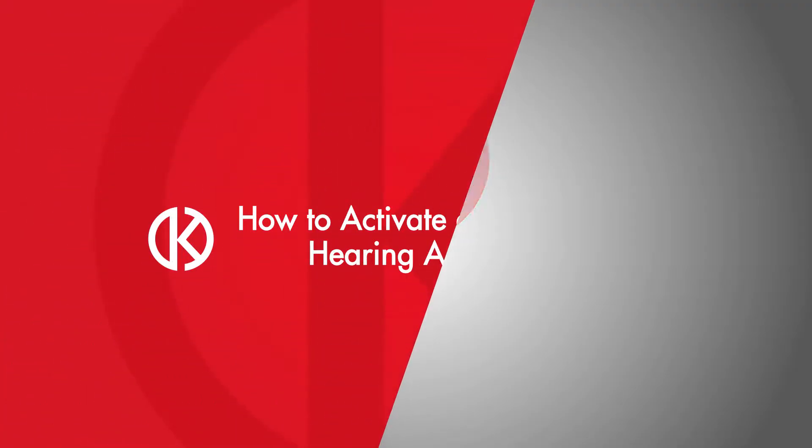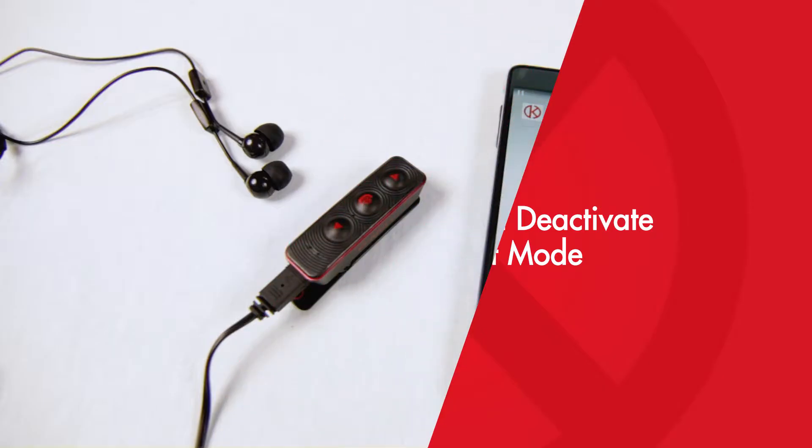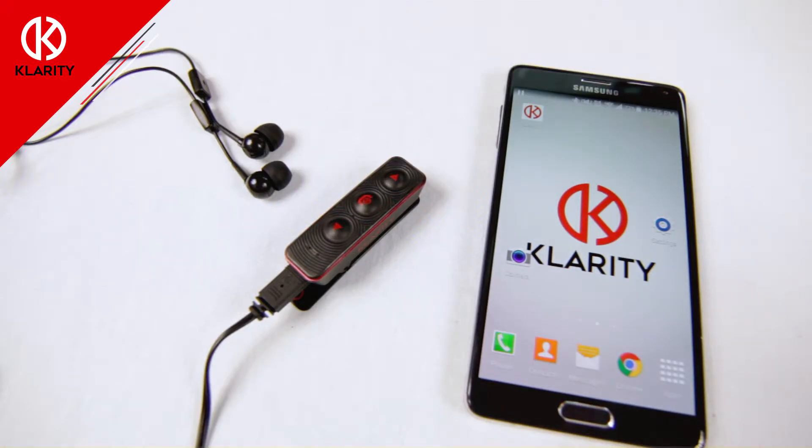How to activate and deactivate hearing assist mode. Step one: with the unit powered on, press the power button once quickly to activate hearing assist mode. The indicator light will blink purple when hearing assist mode is activated.